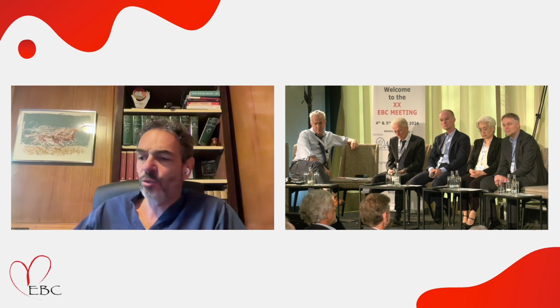On the other hand, if we randomize patients up front, the risk is that there is a slightly higher bailout stenting rate. So this is another fact. In the solution study, Simon presented very interesting data, I don't remember at which meeting, showing that according to the experience of the physician, at the beginning of the experience, bailout stenting was quite high, and after few months of experience with DCB, it came down. So this is my comment on if to predilate before or after randomization.